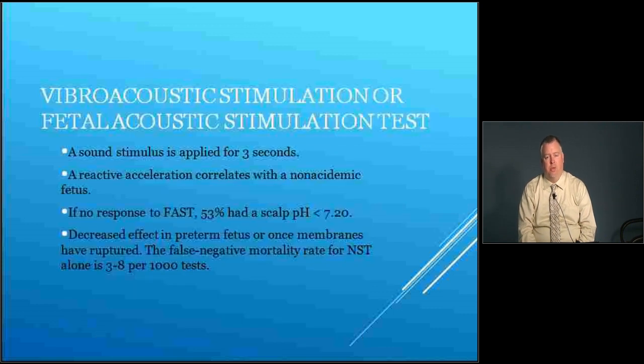Sometimes, as you know, the fetus is not always reactive right away when we put them on the monitor. So one thing we can do during antepartum testing is to do vibroacoustic stimulation or fetal acoustic stimulation testing. That's where you apply a sound stimulus to the mom's abdomen for 3 seconds, and then we see if the baby responds to that.